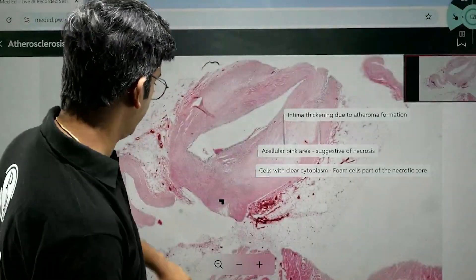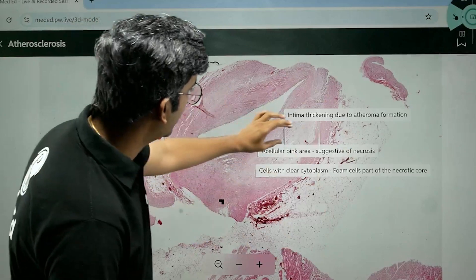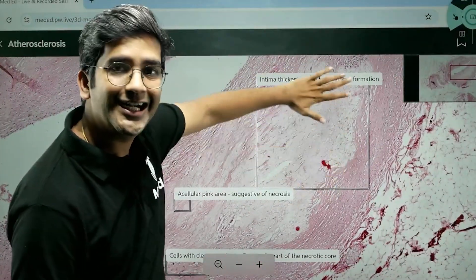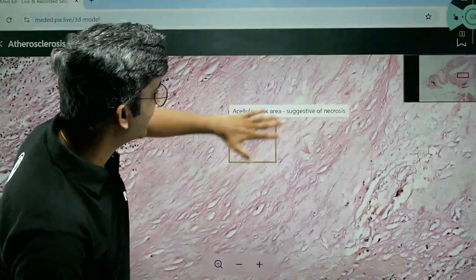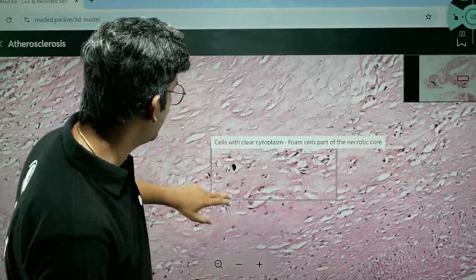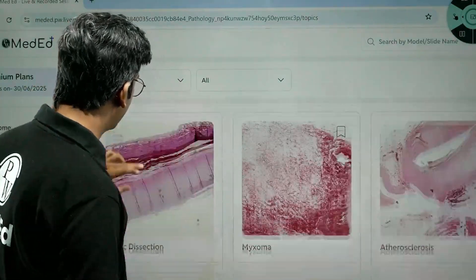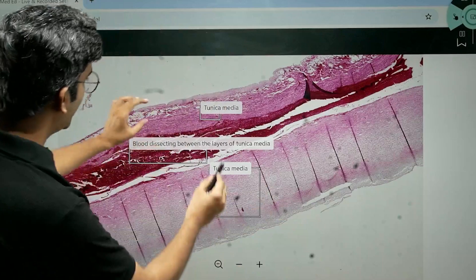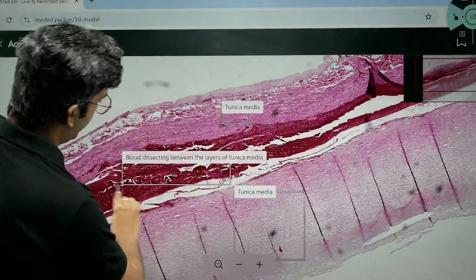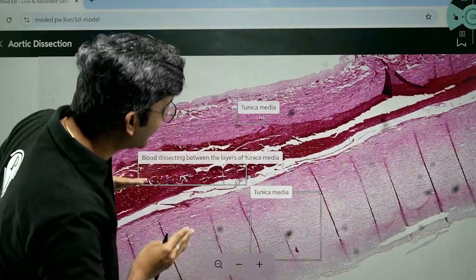Let's go to atherosclerosis. This is the entire wall of the vessel. The intima is thickened completely due to a clear area — that's fat deposition. There's also a pink area which is the necrotic area, because atherosclerosis has a necrotic core with lots of foamy macrophages. And yes, we do have foamy macrophages — cells with a clear cytoplasm. Visual memory helps a lot. Aortic dissection is something every undergraduate gets confused about — where exactly is the blood going? You have the tunica media and blood dissecting between the layers of the tunica media. You'll never have a doubt again about how to differentiate an aneurysm versus a dissection. That's what the digital slide is there to offer.